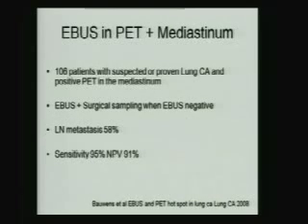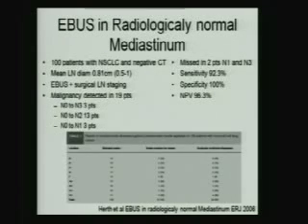EBUS was also evaluated in multiple subgroups of patients. This is to show the patient with PET-positive mediastinum, and it also showed high sensitivity. Interestingly, EBUS was also shown to be quite helpful in patients with radiographically normal mediastinum.